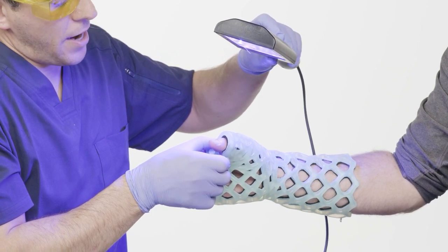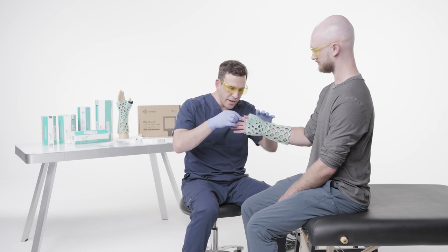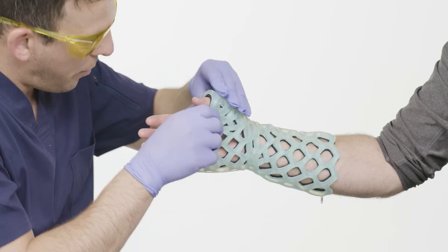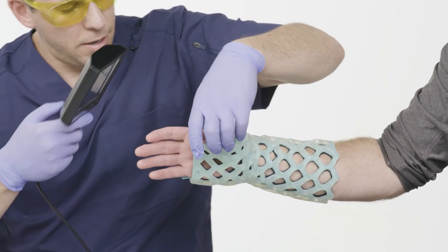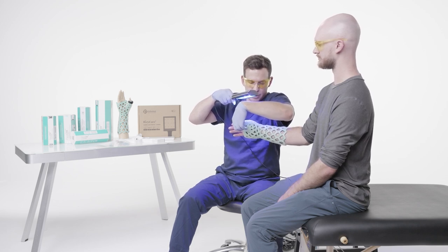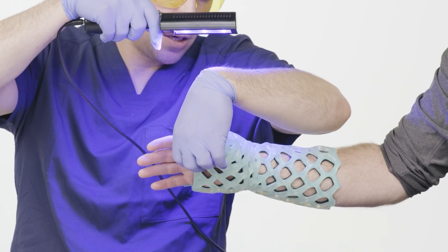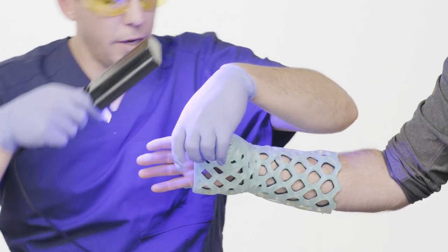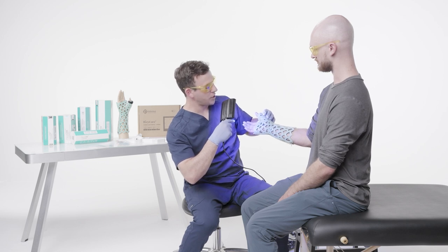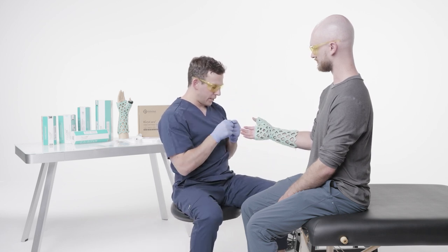My patient is in a perfect position — the thumb should be parallel to the index finger, and it looks like it is. So if I went to shake his hand, it should feel pretty natural. I have a couple more soft areas to cure. I'll have the patient bring the thumb back as far as he can, cure those remaining areas, and then put the Velcro strap back on to help secure everything.